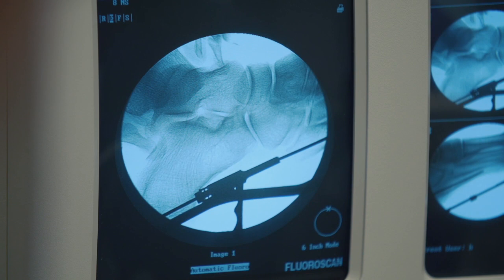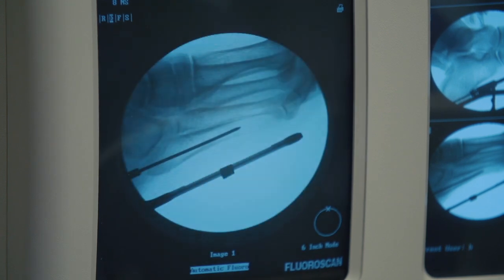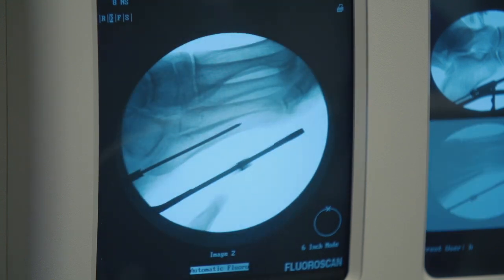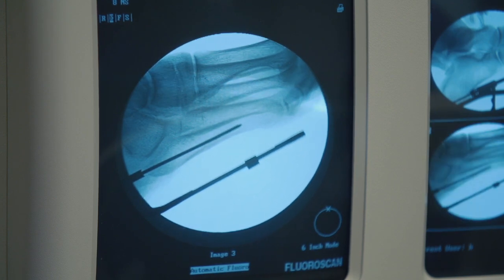The second feature of this new targeting guide is it allows us to push the guide directly against the base of the fifth metatarsal. You need to make sure that you're firmly seated at that proximal insertion point for the peroneus brevis. Then we can move our C-arm more distally and read directly off of the guide, pushing the slide to the end of our guide wire and measuring directly off of the guide for the length of our screw.